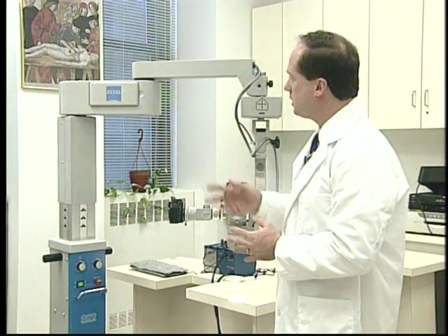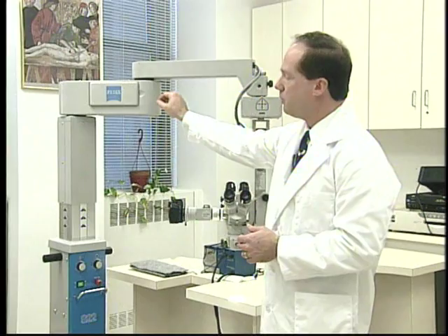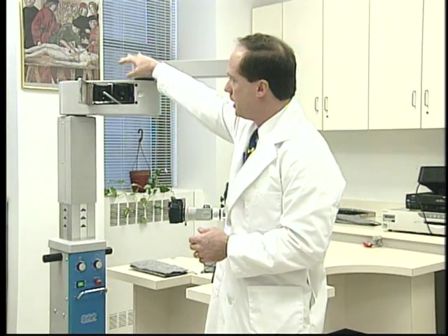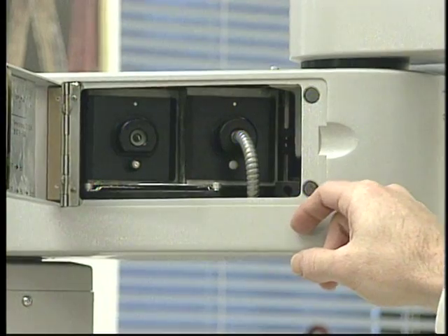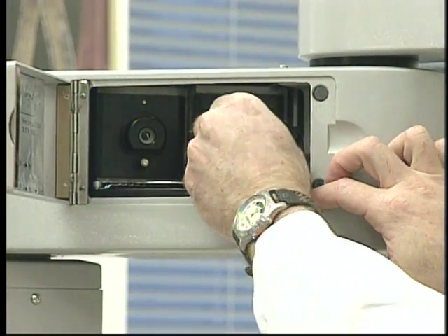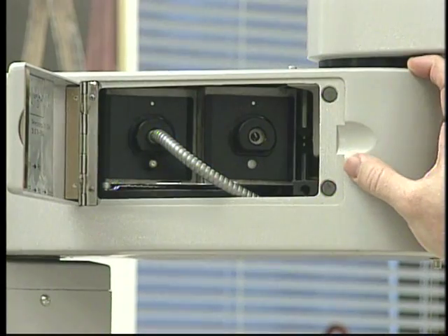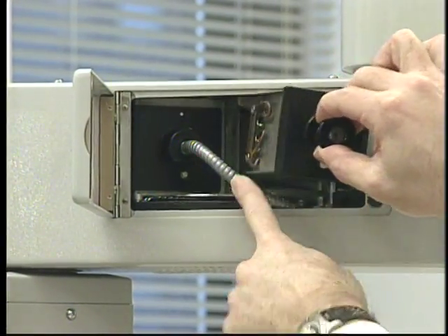Every microscope is a little bit different, but there's usually an area where the light source will be contained. This particular scope has a little drawer, or it may be on top of the scope or on the side. Now, one of the things you might want to do if the bulb blows out is to detach the light source cord and plug it in to the adjacent bulb, which should be working. If the adjacent bulb is blown out, then you're going to need to change the bulb.